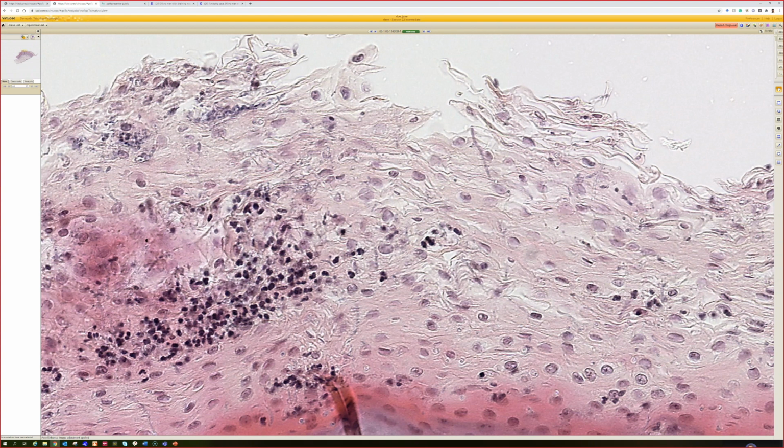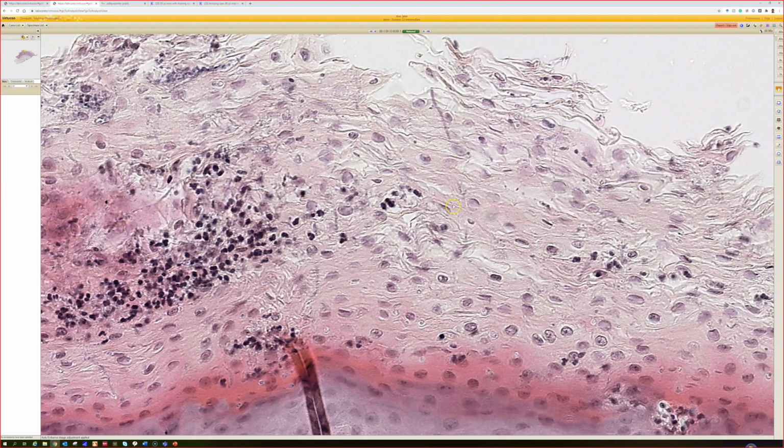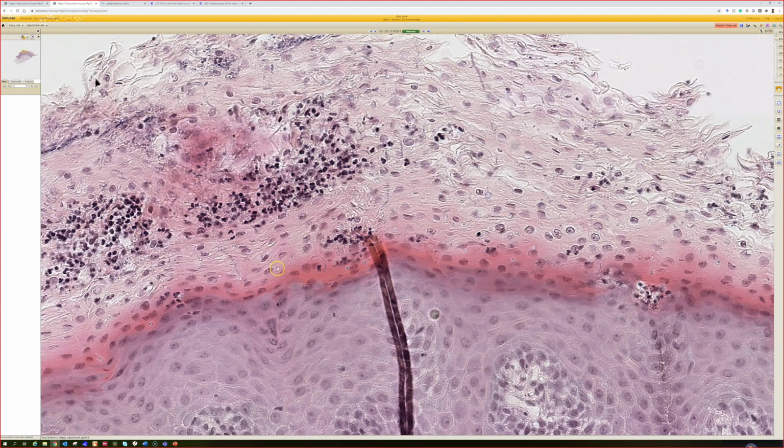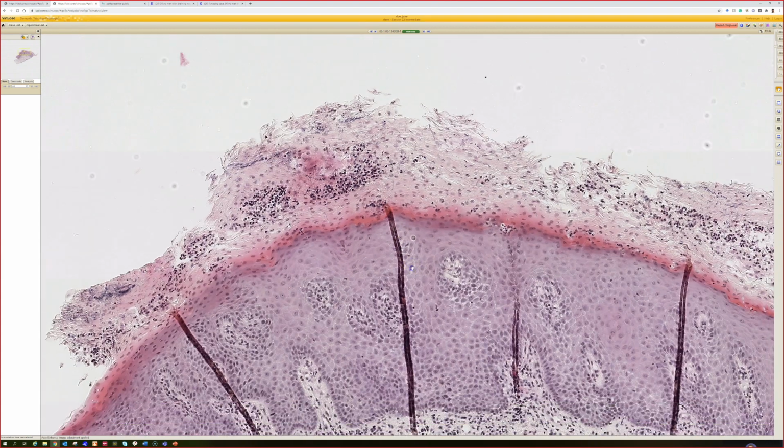If I'm really not sure, I say that there's fungal organisms and that it could be this, it could be Candida, but dermatophyte or Malassezia would enter the differential. That way, make sure you treat it with something like ketoconazole or one of the drugs that will cover the fungus broadly, rather than nystatin, which will just cover Candida but not dermatophyte fungus, right? So if I have any doubt, I'll just say there's superficial fungi, and then I'll tell you which one I favor. But in any case, those are some clues and tips to telling those apart.